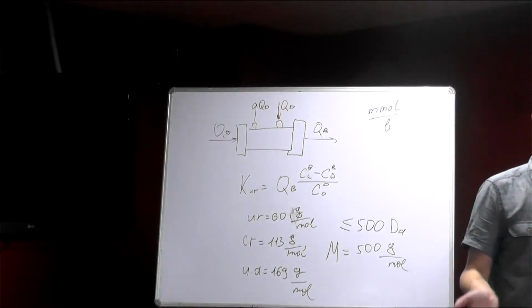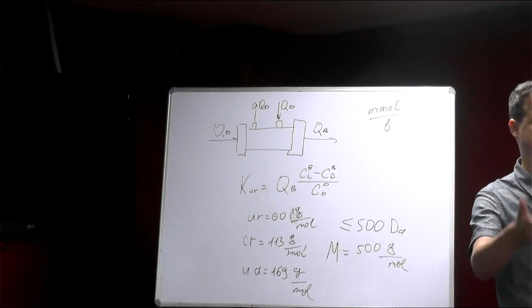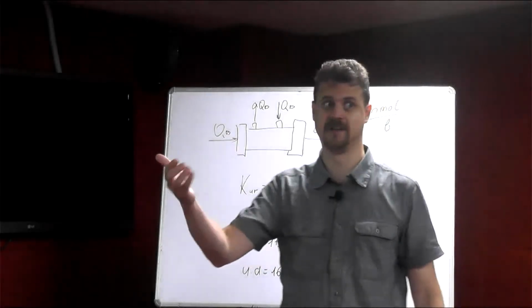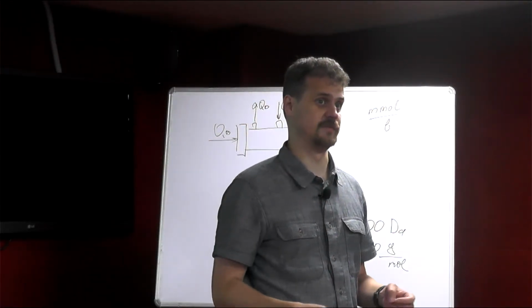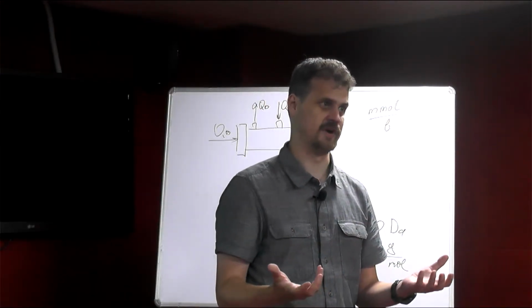when we talk in the perspective of the lecture that we had about the digital twin, we need to actually apply machine learning for the digital twin to verify and validate this system for the implantable kidney. And for that reason, we need to collect some data from the implantable kidney. And for that reason, we need sensors as well.